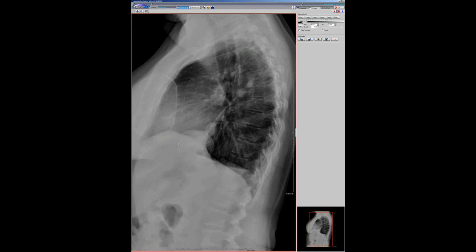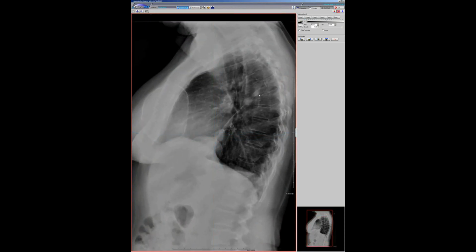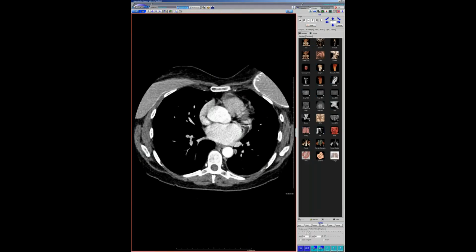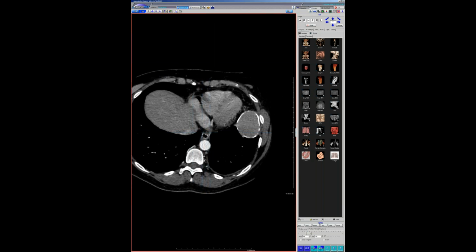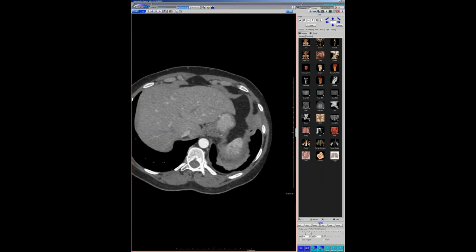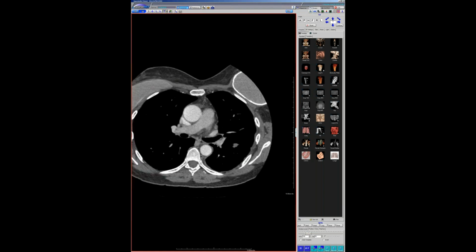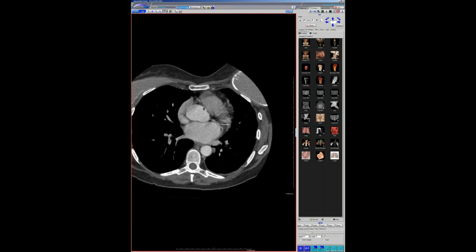That's why she got the second breast implant, because I guess the first breast implant was gone, and she never really knew. They kind of told her, oh, something happened. And anyways, you can see there's this strange stuff along the fissures. Somehow, going in through the axilla, I don't even understand how it happened, they got into the breast implant and created some sort of communication between the breast implant and the pleural space, and the silicone from the prior breast implant just leaked into the pleural space. And you wind up with all of these silicone globules studding the fissures. It's almost like a pleurodesis.